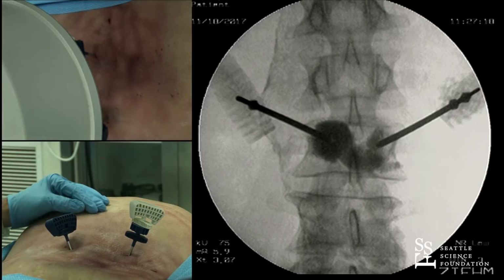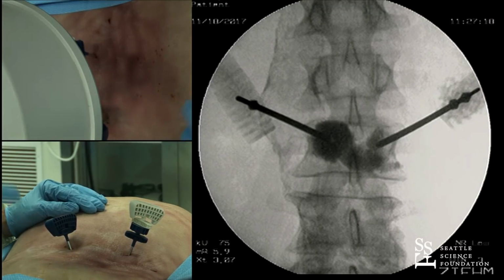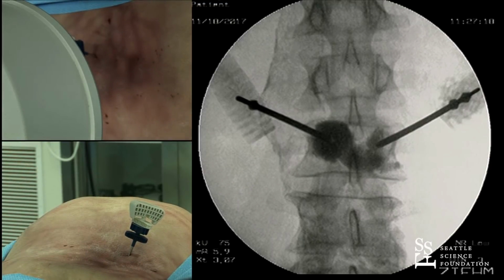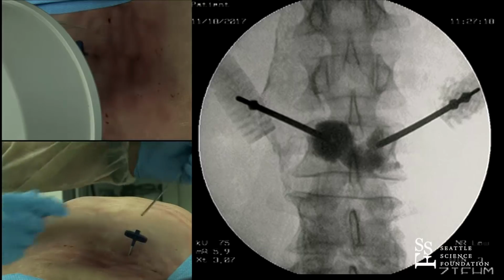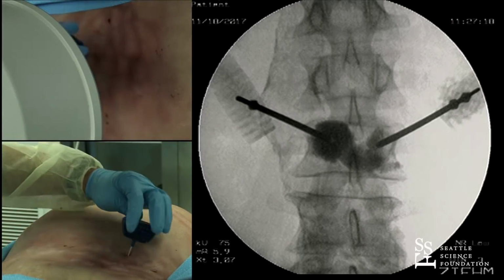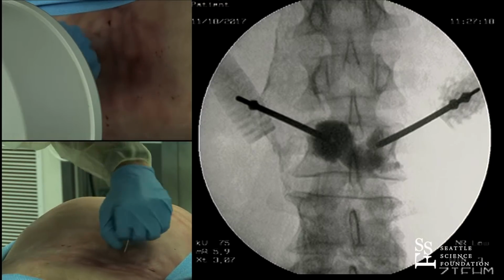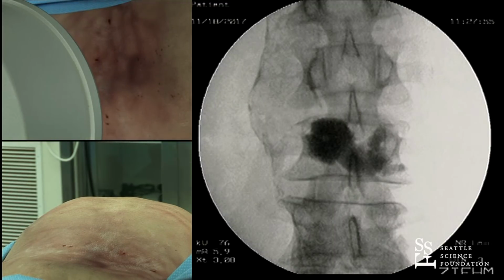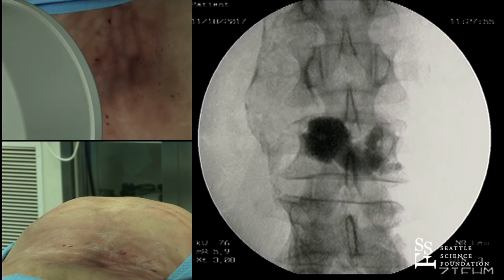And you can even put a filling device in and tap it, and it will make a clicking sound, a click, when the cement is hard. So you don't want the cement to back up on you, so you take the internal components out, put the stylet back. If the cement is liquid enough, it will back up on you and it will leave a tail. And that's not necessarily the worst thing in the world, but it does make it look funny. So you want to avoid that. So we're pretty happy with this.